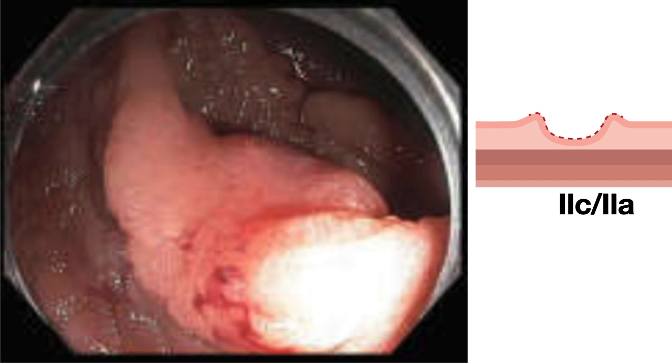I don't have a 2C lesion to show you, but here is a 2C lesion with a little bit of 2A. This is the mixed lesion.